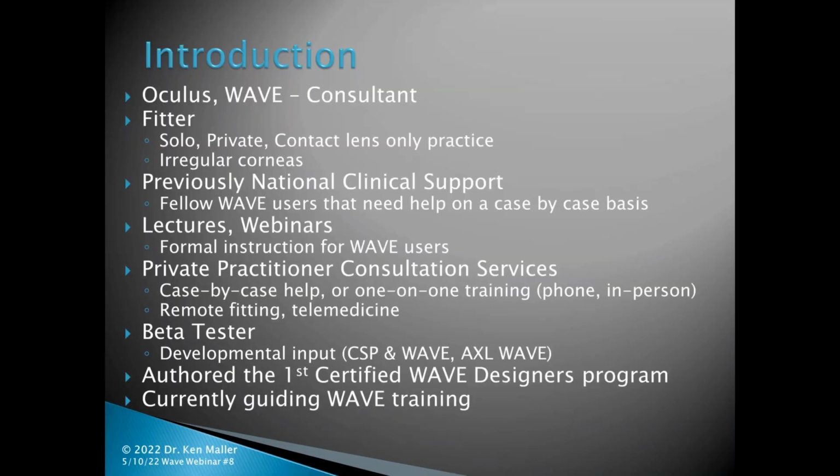First, an introduction. I do consult for both Oculus and WAVE. I am a contact lens fitter in private solo practice. My practice is basically contact lenses only, and it's really focused on irregular corneas, as well as myopia control and orthokeratology. I previously did the national clinical support for WAVE, as well as have presented formal lectures and webinars, just as this one tonight, as instruction for WAVE users.